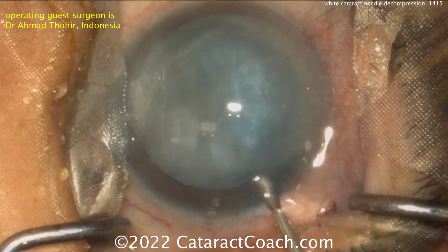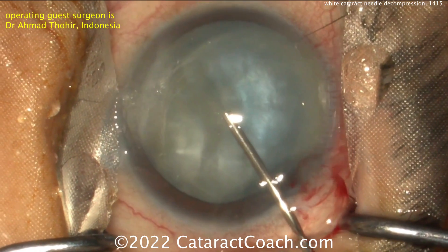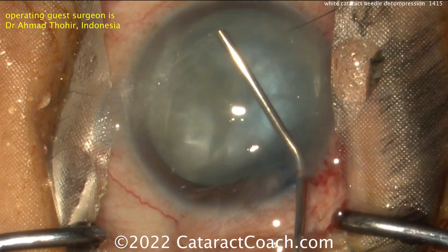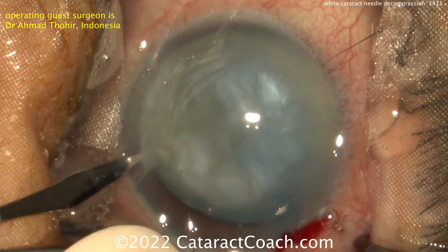You can see this is a cataract that is intumescent. The liquefied lens cortex is pressurizing the capsular bag. TriPan Blue Dye was used. Now you can put viscoelastic and you can see how pressurized that bag is.